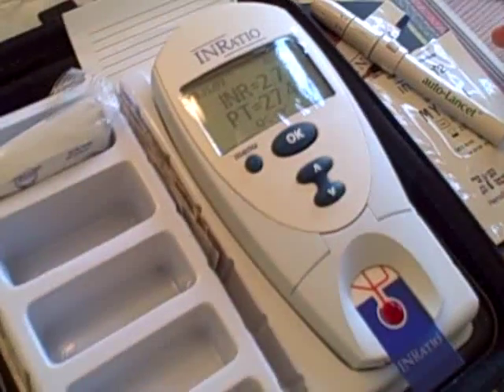We recently discovered when we were in Amsterdam that in the Netherlands, 50% of people self-test on Coumadin, as opposed to 2% in the United States.